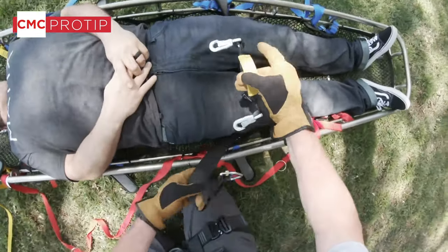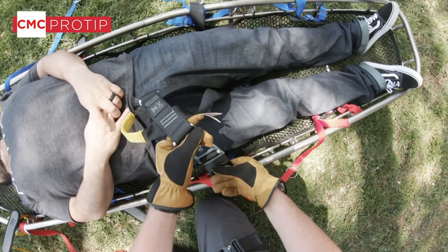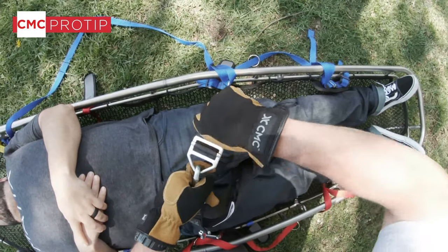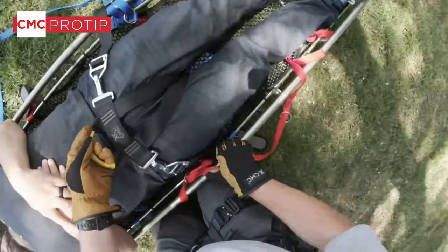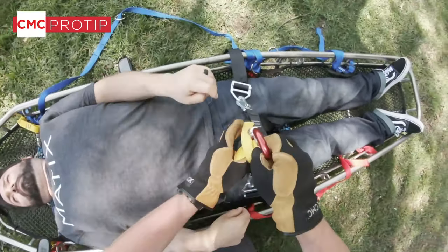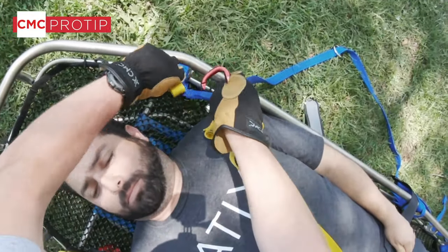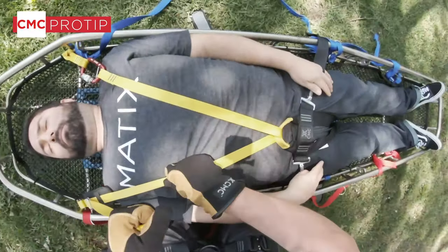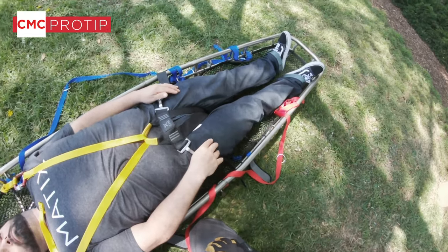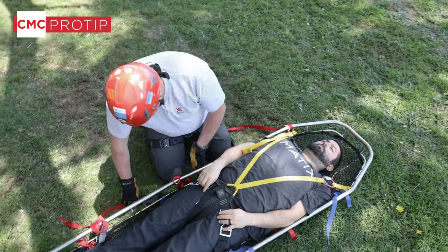We're going to find our yellow strap and snap in our leg loops on both sides, working out any twists, and snug these up. Once that's snug we'll place our yellow strap through and connect to the second half of the yellow harness — everything is color coded to make it easy. Make sure to get the twists out so it's more comfortable. This keeps the patient from sliding down, which is especially important if the patient has a leg injury — we don't want them sliding down and having their feet contact the bottom of the basket, which could put them in a very uncomfortable position.